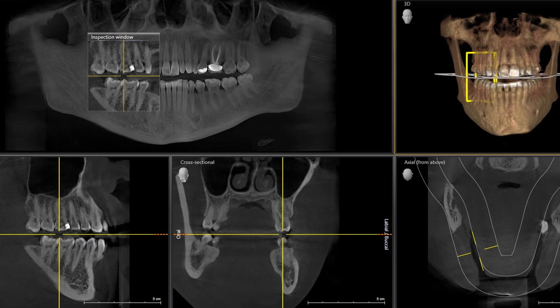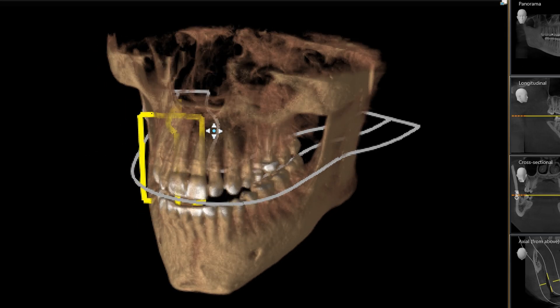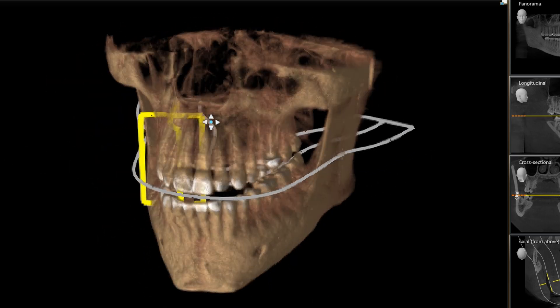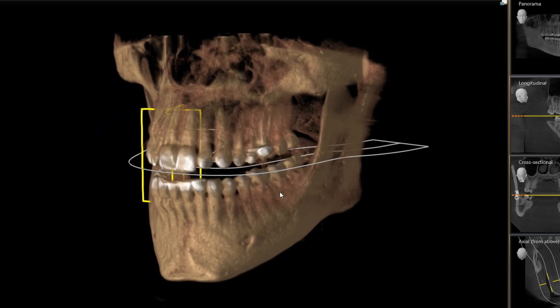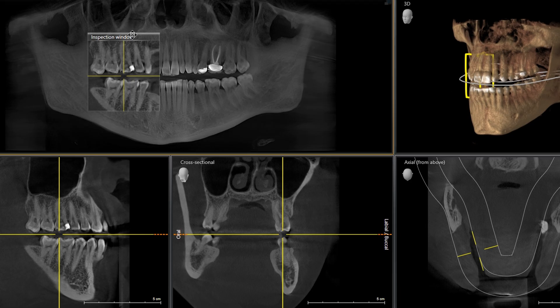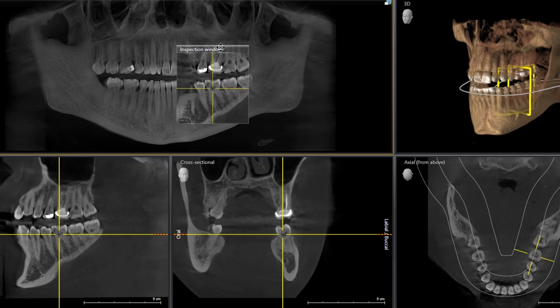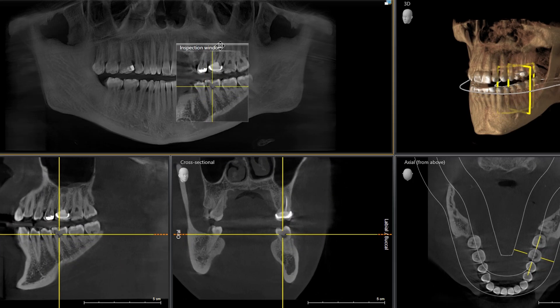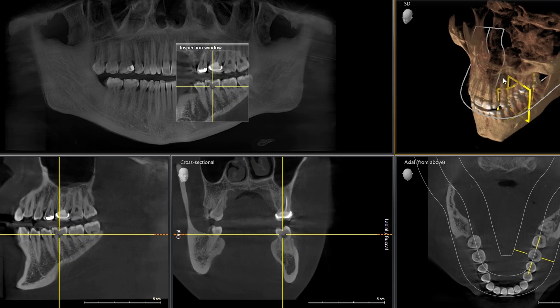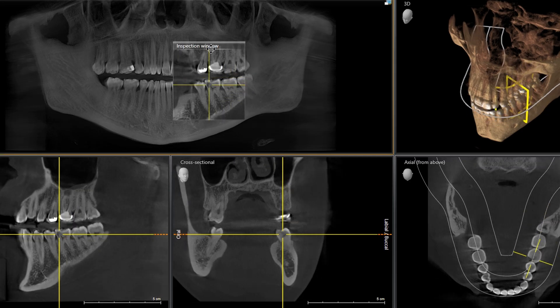We get to look three-dimensionally at the patient's skull and see things we would never otherwise be able to see. This patient's concern was on a tooth down on the lower left. As I move this inspection window around, you can see these three planes representing three windows moving around in her skull.